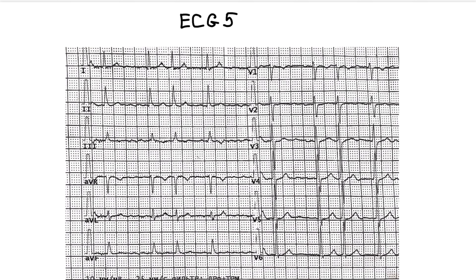Now let's think about the rhythm here. We look for the p-wave, but there are no p-waves. The QRS complex is narrow and not widened or deformed. The rhythm is irregular. This is atrial fibrillation. Atrial fibrillation is characterized by the combination of two main features: the absence of p-waves and an irregular rhythm.